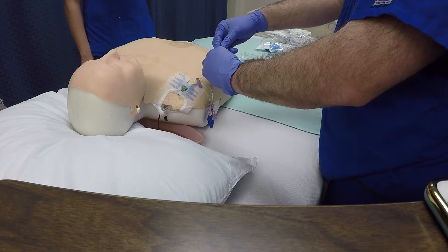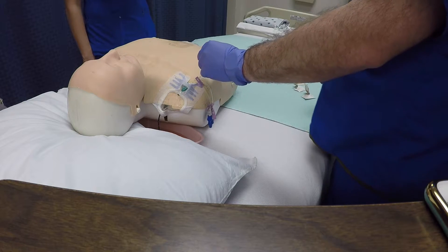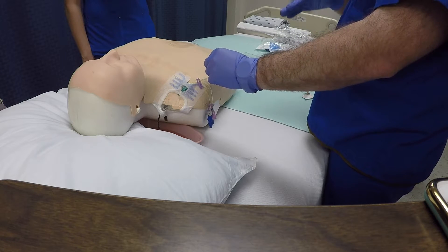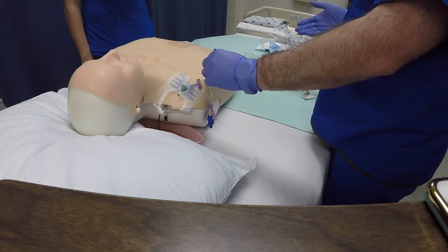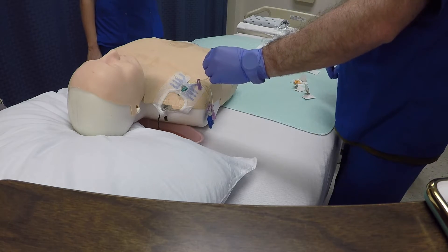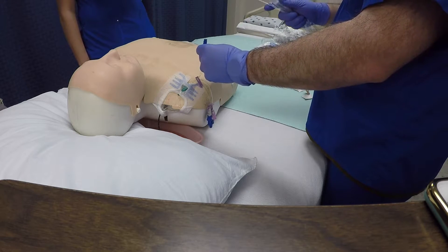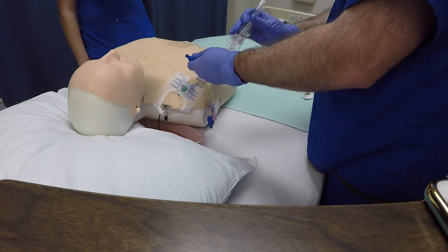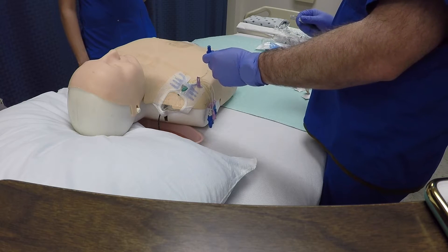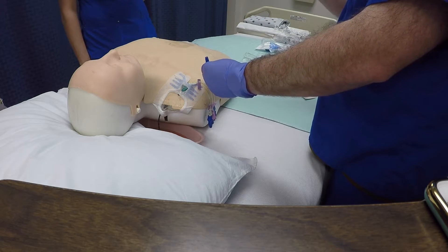The reason for twisting is to disinfect, and the next key point is to dry for ten seconds — the reason for that is to give the appropriate kill time for the alcohol to dry. Step number three is to prepare the line. Key point number one is to flush with ten cc's of saline, and the reason for that is to clear the line.